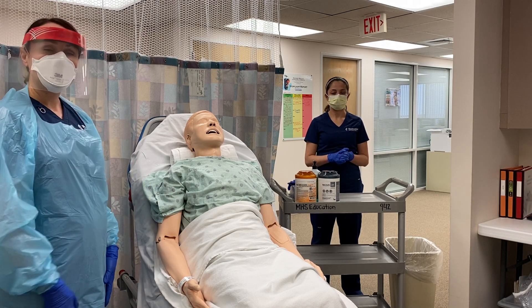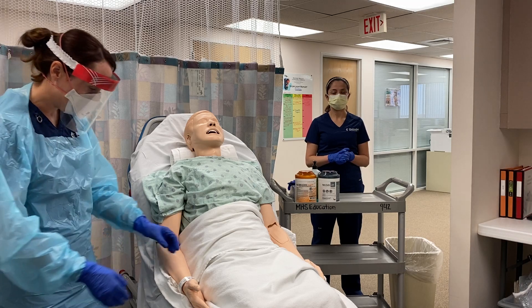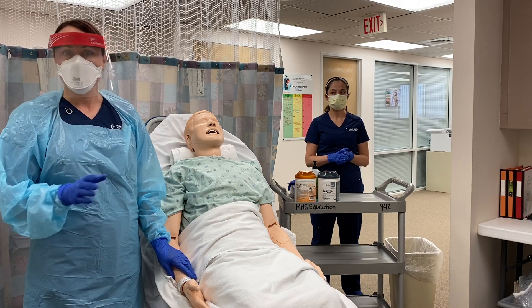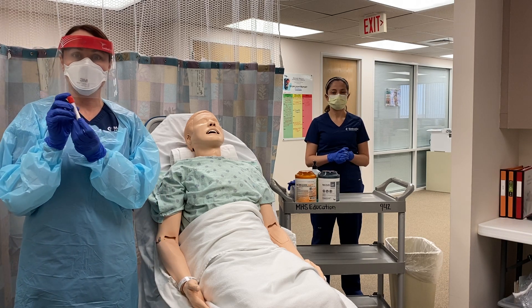When you come into the room to perform the testing, be sure you check your patient's identity first. Take a look at their armband, and then using the Mobi Lab system you're going to want to print a label and place it on your vial of viral transport medium.